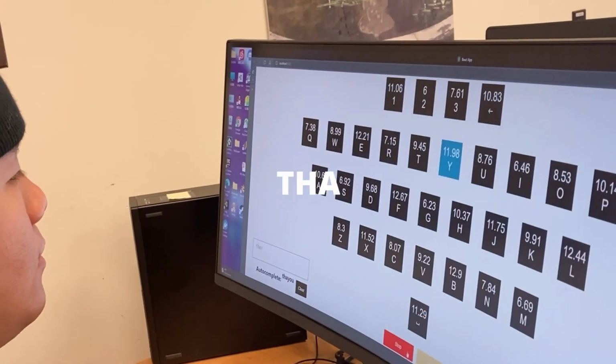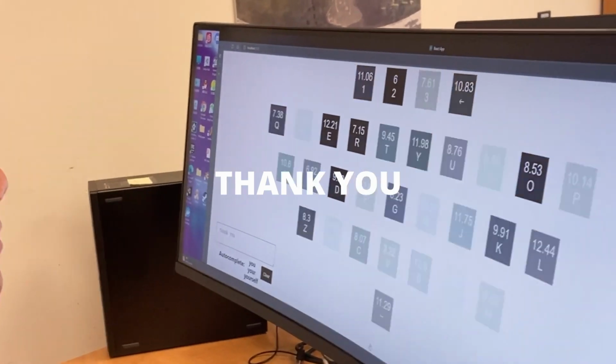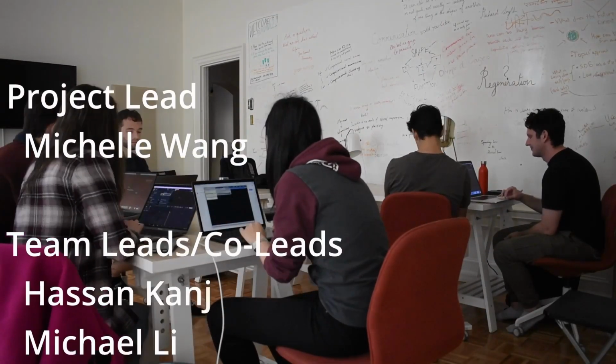One of the challenges our team has faced was when users misspelled words. So if a user had 2 characters that don't lead to any predicted words, our model accounts for the keys surrounding the key that they selected on the keyboard and is able to provide the next most likely words given the surrounding keys.